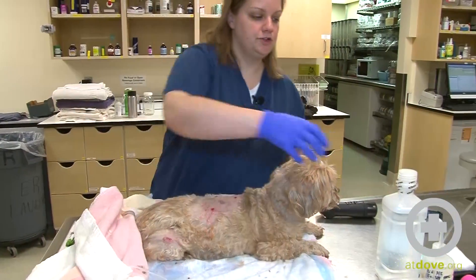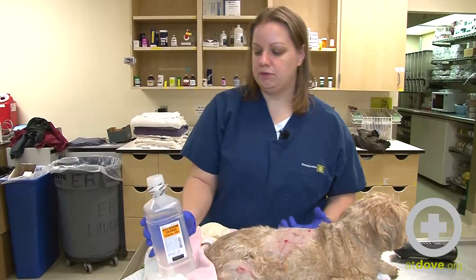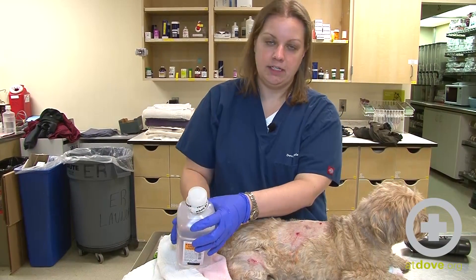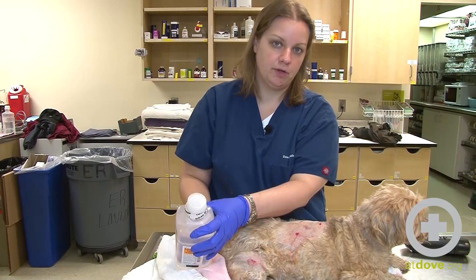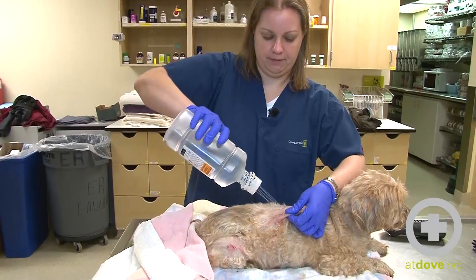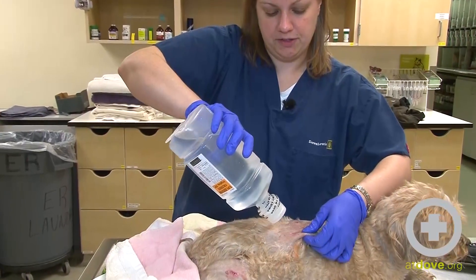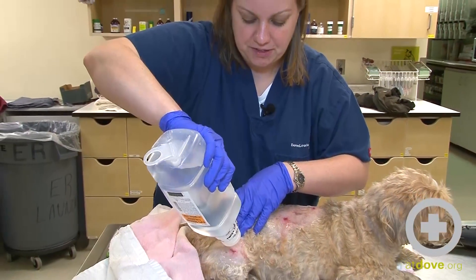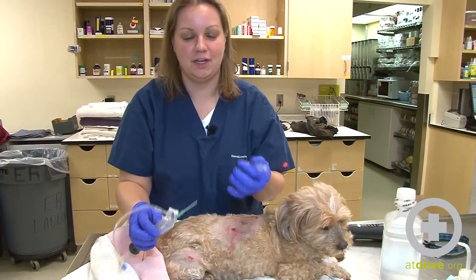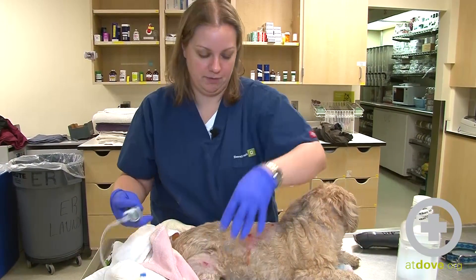Another way to flush out large wounds or wounds that cover a large portion of the body is to use a bottle of saline irrigation — we keep ours warm — and just take an 18 gauge needle and puncture some holes in the lid so it makes like a shower. You can flush large areas of the body that way. Since this dog has all puncture wounds, this isn't the best use of this method — I much prefer the 18 gauge catheter — but it's another option for cleaning out large body areas that have been wounded.